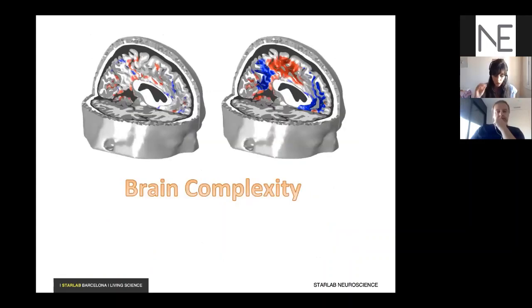Okay, so to sum up what we have seen so far, we have gone from the brain dynamics, from the power of the EEG signals, the single power within each band, to the cross-frequency coupling. We have seen what each band is related to, and then the cross-frequency coupling between two different frequency bands, for example, the theta to gamma phase amplitude coupling, that it's related to binding information from different sensory inputs. And then we have also seen for the cross-frequency coupling that the delta to beta cross-frequency coupling is related to top-down processing of affect regulation.